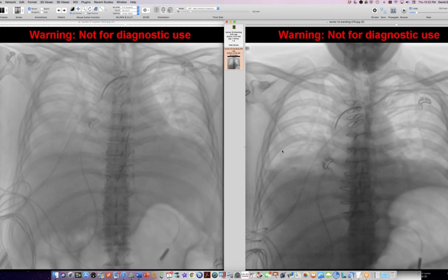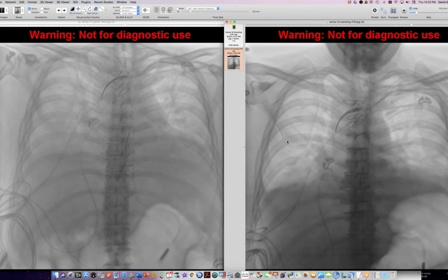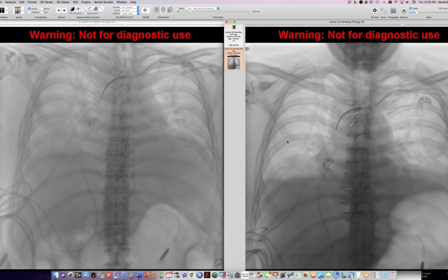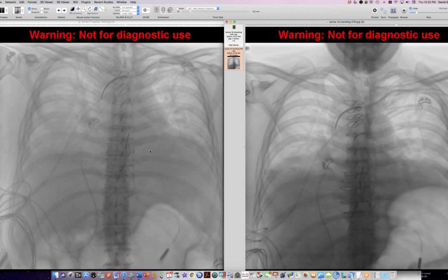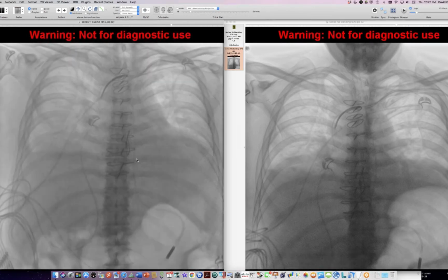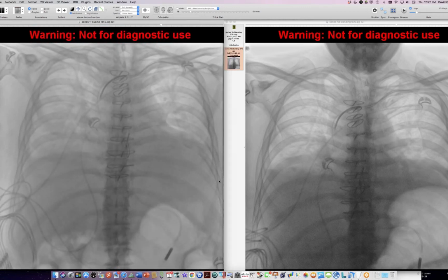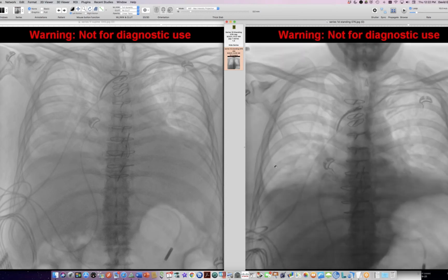So how do you distinguish that? Because the cases where you blow by the paralysis, when it's bilateral paralysis, the most severe diaphragm dysfunction is the easiest to miss. You have to do the supine view to defeat this abdominal breathing and then show that the diaphragm itself is not moving actively, it's just passively being dragged around. So the diaphragm is moving passively here in response to abdominal muscle contraction and relaxation.